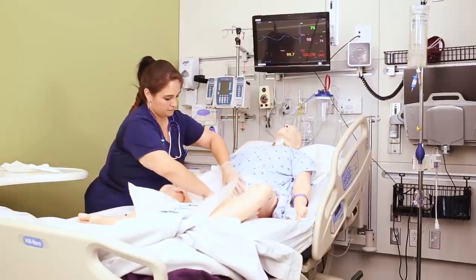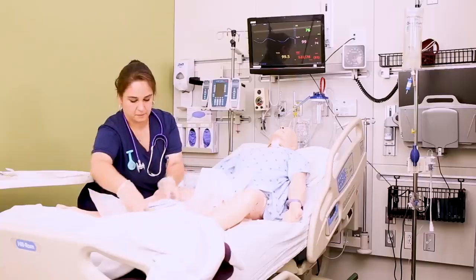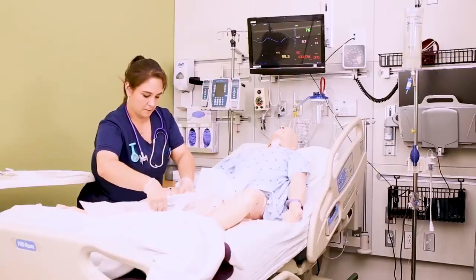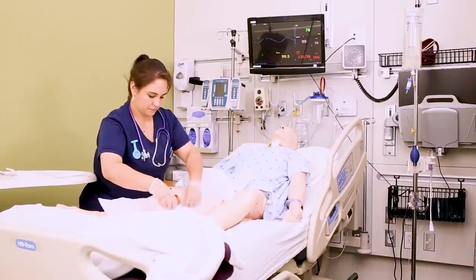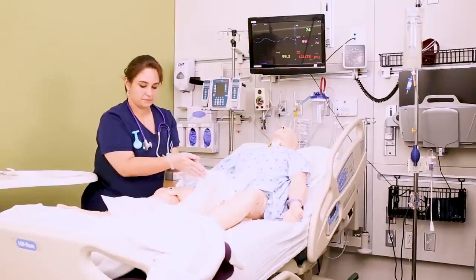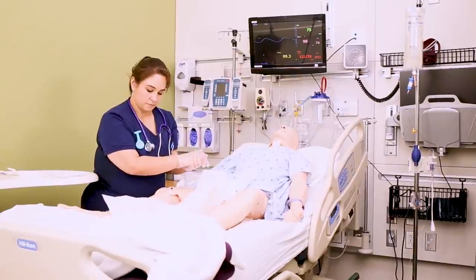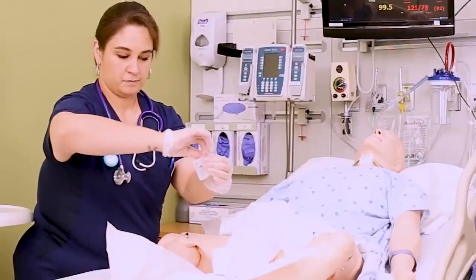Now slide the kit towards the patient's feet and carefully remove the plastic tray. Place the plastic tray on the sterile field a little closer to the patient's perineum — I usually hook it on the side of the cardboard to keep it steady. Now you've got a nice wide sterile field to work with, and you can prepare the rest of the items in your kit.